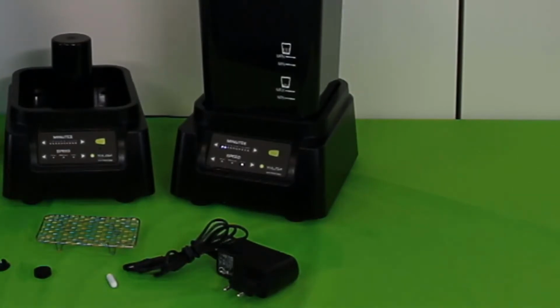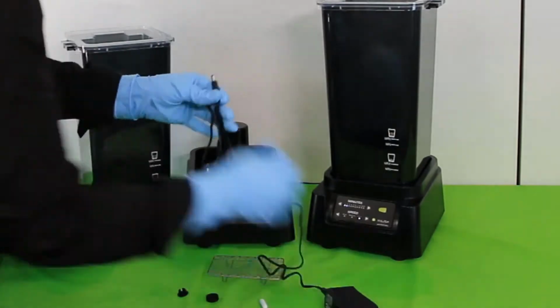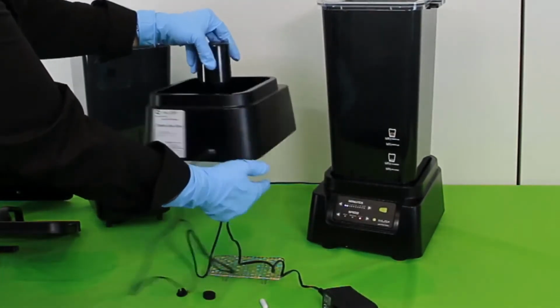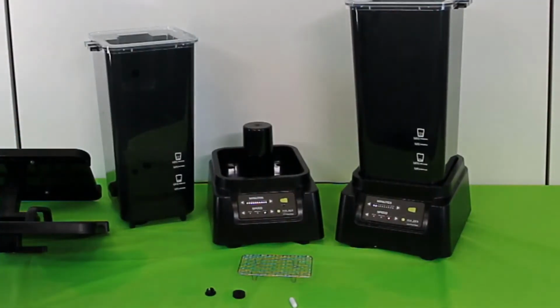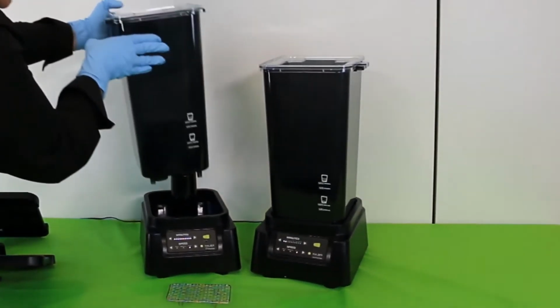After attaching the power plug to the adapter required for your country, connect the device base to the power plug on the back of the device. Connect the Cara Print Clean to the mains. Put the inner and outer container on the base.